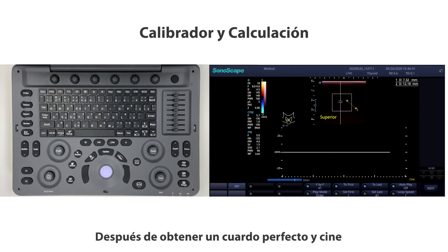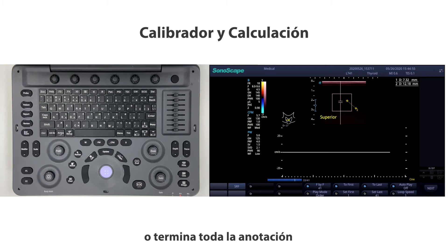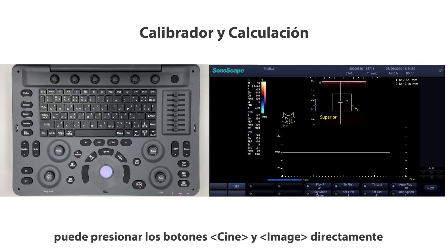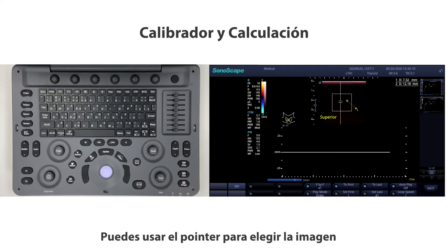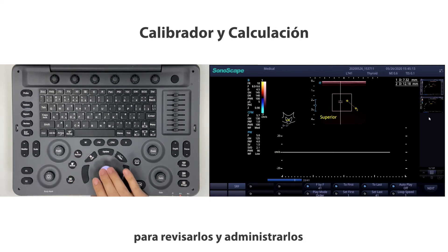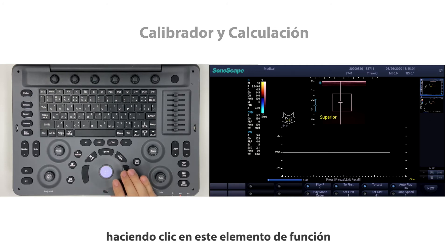After you get a perfect frame and cine, or finish all annotation, body mark, and calculation work, press the Cine or Image button directly. The image and cine will be saved in the gallery. You can use the pointer to choose an image to review and manage them by clicking the function item.